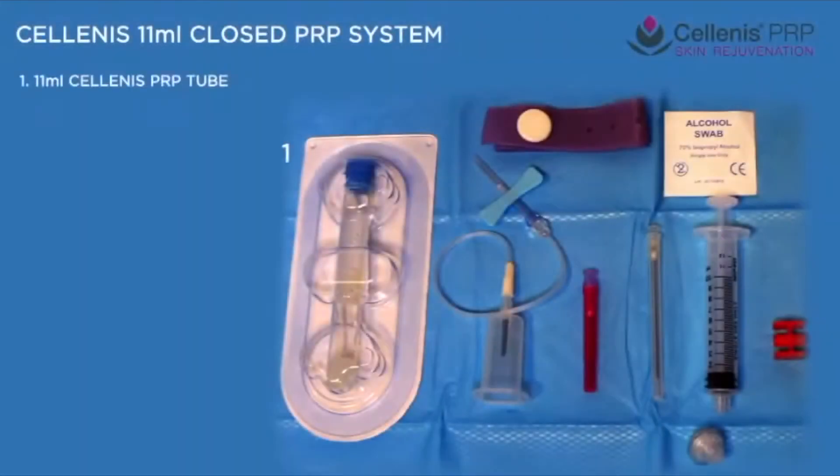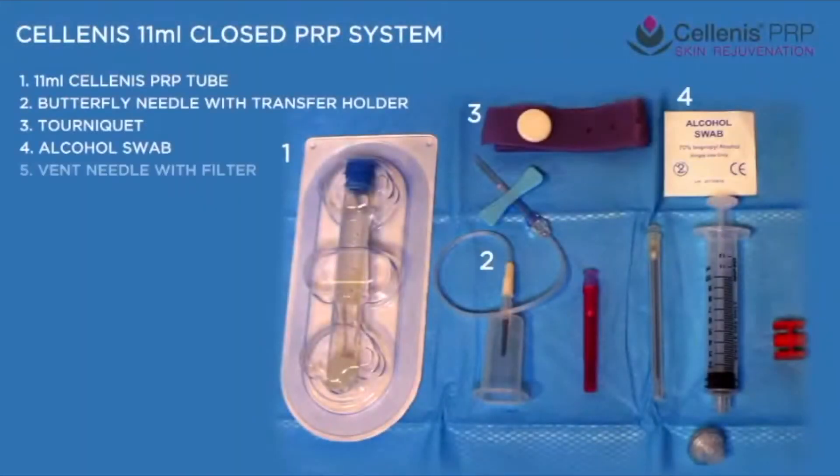The Cellenis PRP kit provides everything needed to prepare Cellenis PRP.